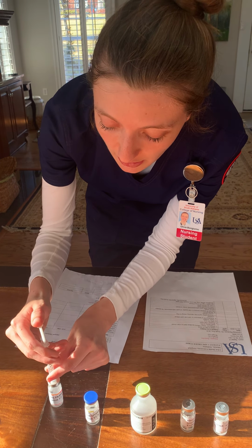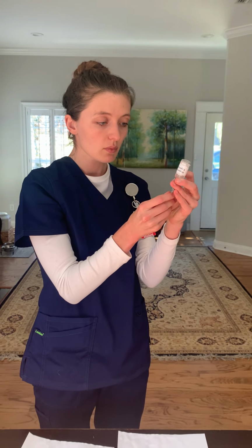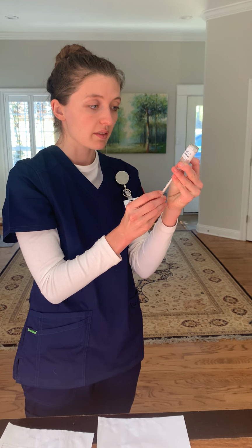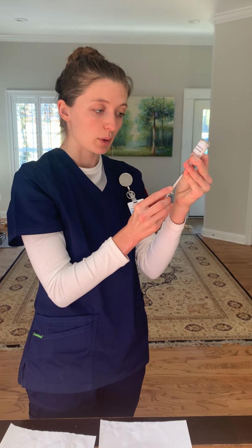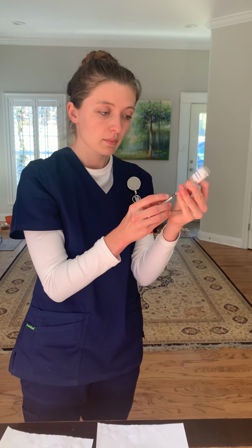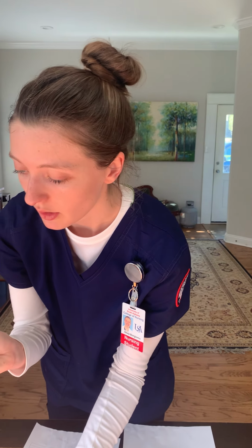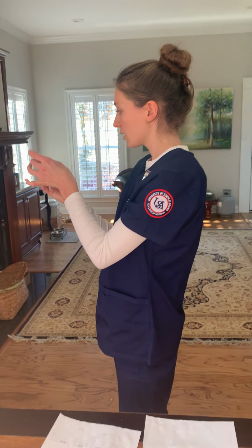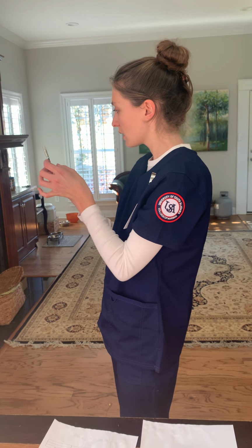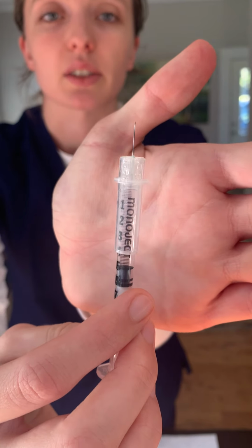I will push in the air, and I will draw out 0.5 milliliters of the heparin. Make sure there aren't any air bubbles. So there's my 0.5 milliliters of heparin.